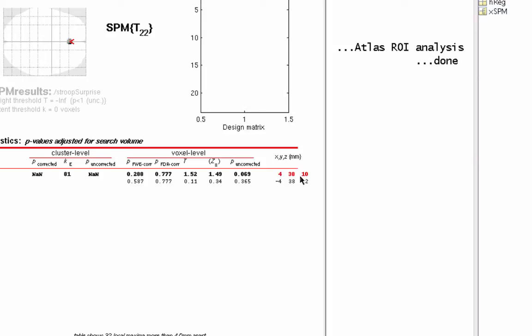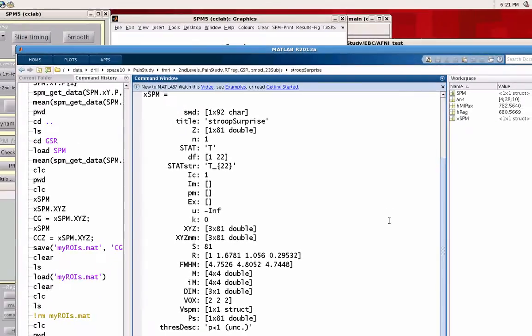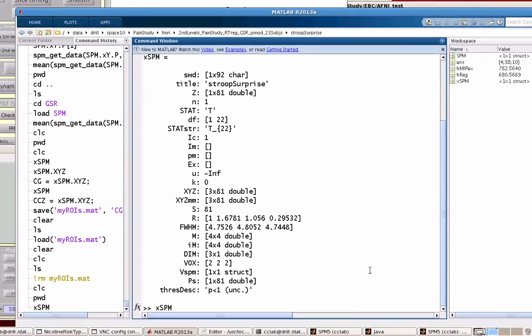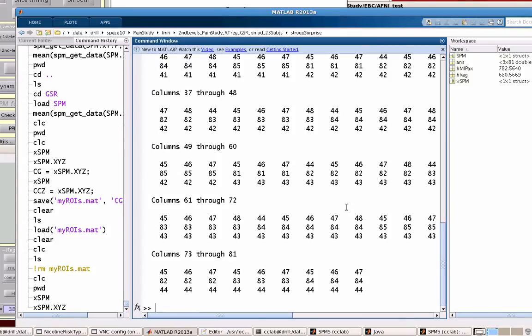After we did the results, XSPM has already been generated. This is a structure which has a bunch of different attributes. Within this, we have XSPM.xyz, and this gives me 81 columns. And not surprisingly, there were 81 voxels in that ROI that I created in MarsBar.